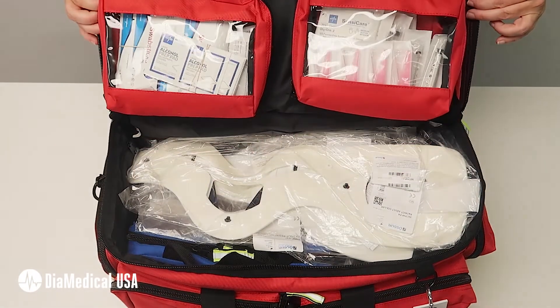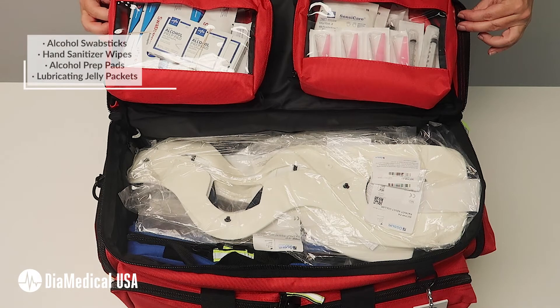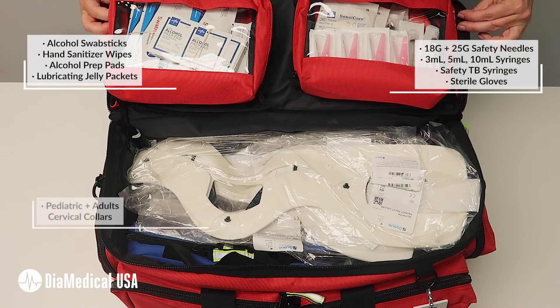Two removable zipper pouches with transparent windows are attached to the top flap with velcro. They provide quick access to commonly used supplies such as alcohol prep pads, needles, and syringes.